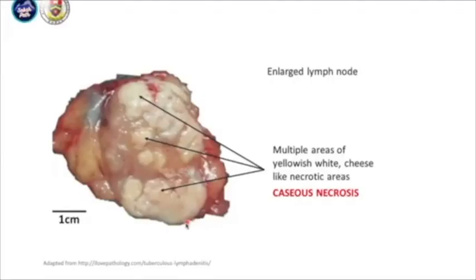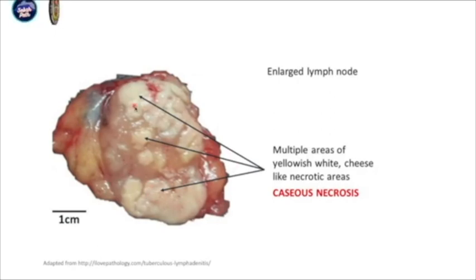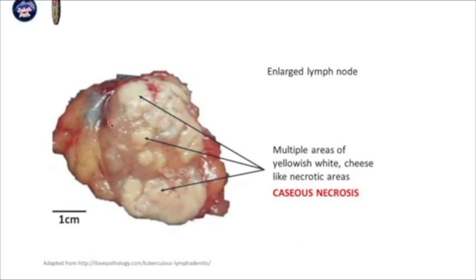We go to the first case. In the gross section, you can see the lymph node is significantly larger — about 5 cm. And you can see there are multiple yellowish areas. Usually when you palpate it, it is a bit soft and cheesy, like this necrotic area, which we call caseous necrosis. This is the characteristic here. Usually in this lymph node, it doesn't affect the whole lymph node — there are some areas which are preserved, and this area is affected by the caseous necrosis.